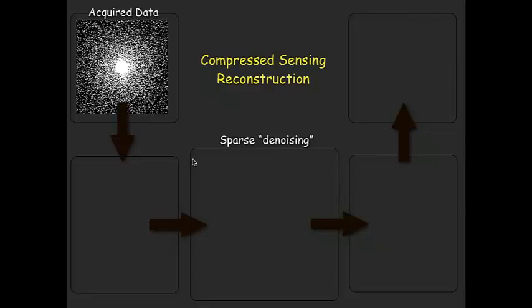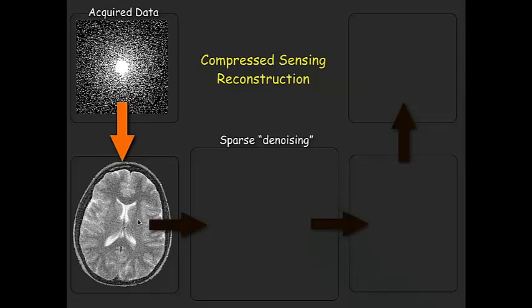So now, how does a compressed sensing reconstruction actually work for images? Let me show you an intuitive example, although this is an algorithm you can actually implement, and I'll show you a link where you can download a tutorial that you can go through. So we start with acquiring randomly subsampled variable density data. We reconstruct an image by just doing an inverse Fourier transform with zero filling. Now this is corrupted by interference. Okay, so we can kind of see through, but it's still corrupted.